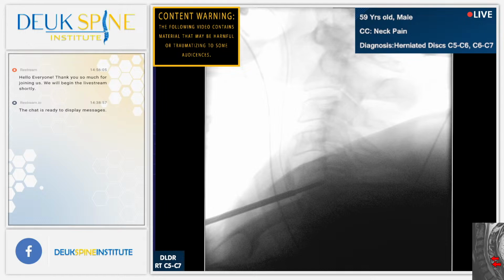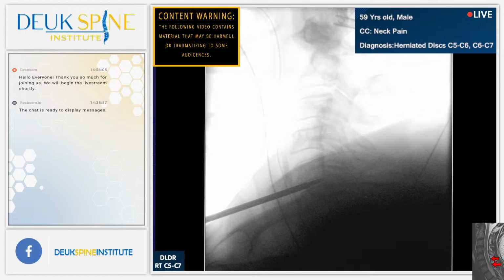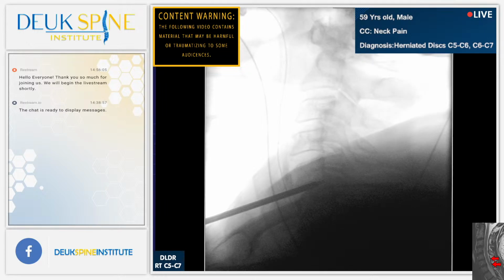All right, I need inline traction. Ready? And I need a good view. Shot? A slight extension? Slight extension. Shot? Uh-huh. Shot? Man, there's something very hard in there. It's not calcium, but it's shot? Scar tissue, or I don't know. We're right at the back. I think I can work with this. I want to try to get a little bit further.